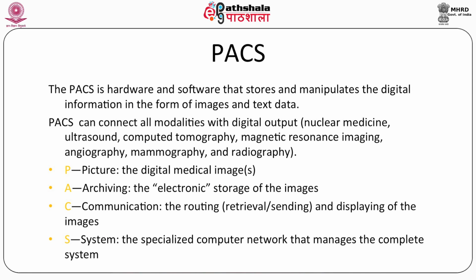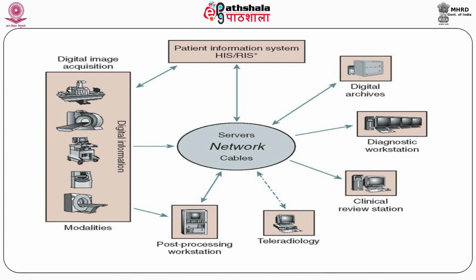Now coming to PACS, the picture archiving and communication system. PACS is hardware and software that stores and manipulates digital information in the form of images and text data as shown in the figure. You can see here the data once recorded can be processed, and after processing the data it can be sent locally.